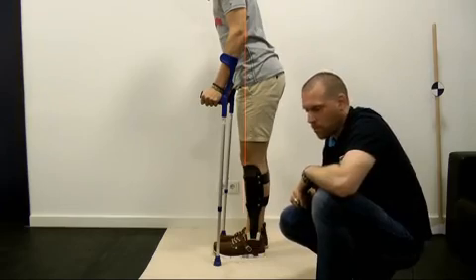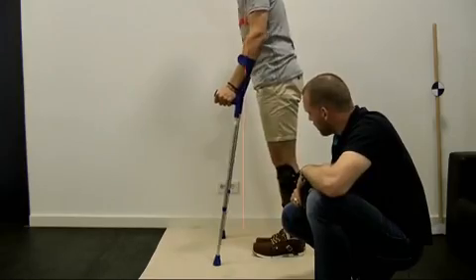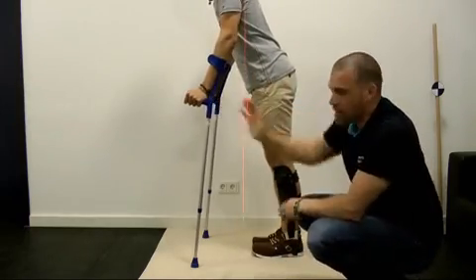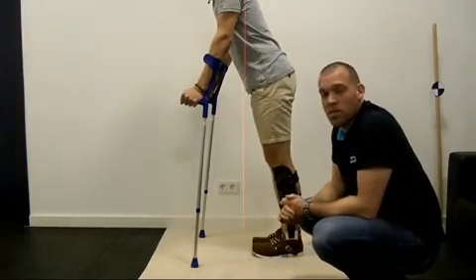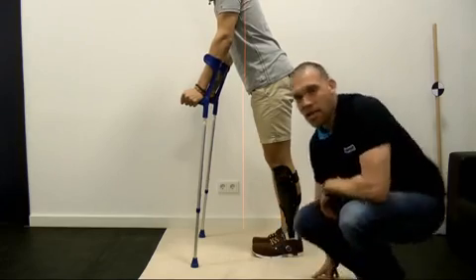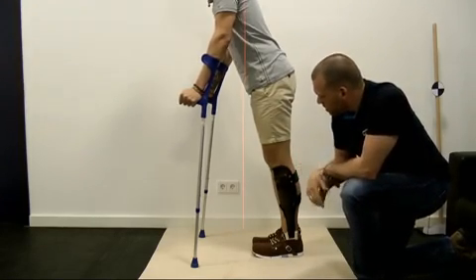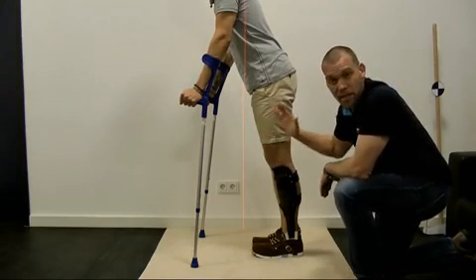So, if Henrik would now feel the need to move the crutches forward, let's say in order to artificially increase his base of support, then we would know that the device or orthosis we have built has basically missed its target and it's not doing what it is supposed to do. It is not able to give Henrik the stability that he needs to feel safe.